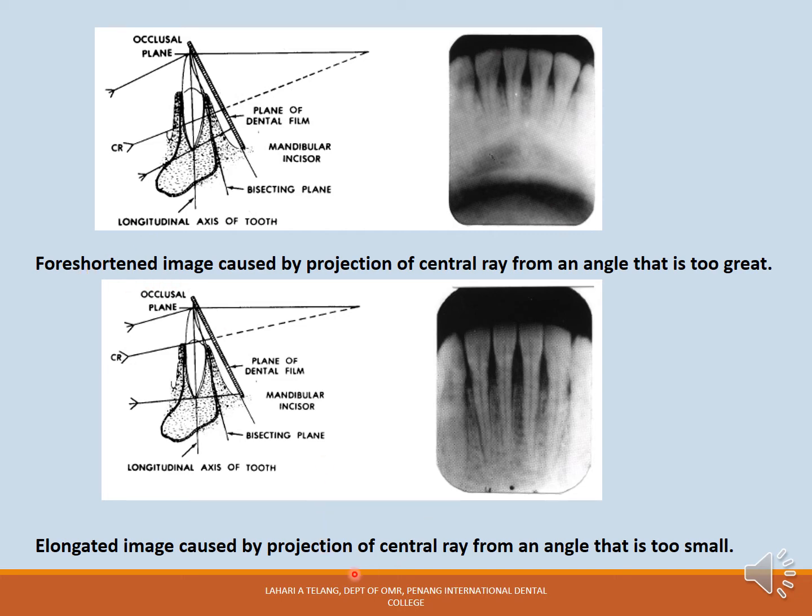On the other hand, if instead of minus 15 you end up using an angle which is only minus 5, you end up getting a larger image of the tooth, which is an elongated image. So in both these cases, the final image becomes non-diagnostic.